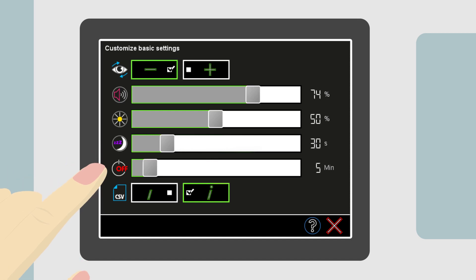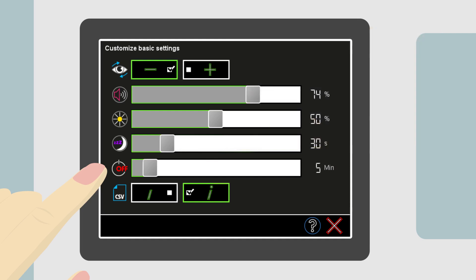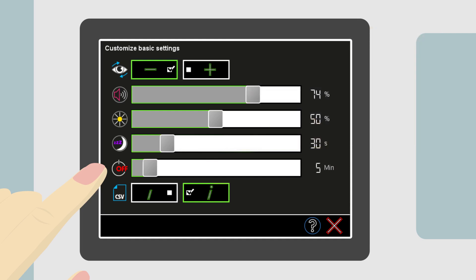Next is the automatic shut-off timer. The device arrives with a default setting of 5 minutes. This means the device will automatically shut itself off after 5 minutes of non-use. The automatic shut-off timer is deactivated when the power supply is connected to the A12 device.